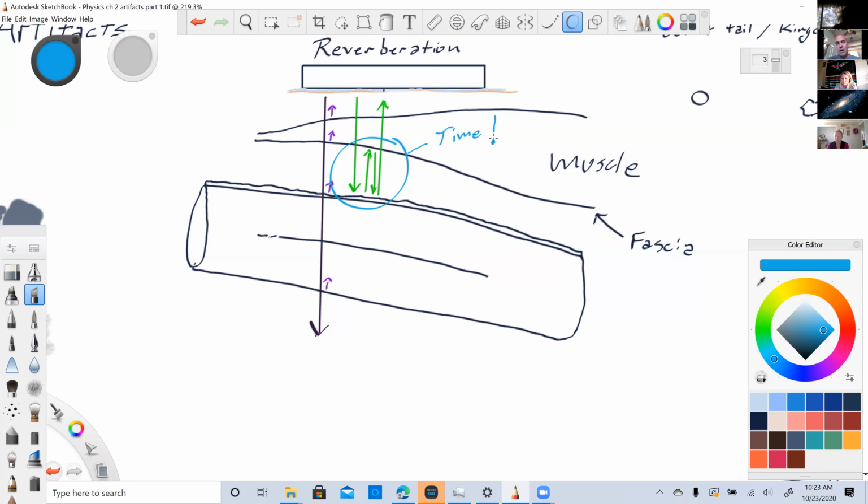And remember, our ultrasound machines are range finding machines. Range, downrange, distance, depth. These are range finding machines, and they use precise microsecond timing to determine where every echo came from. We've messed up the timing, and therefore the machine thinks that there has to be a line of echoes inside of the carotid.